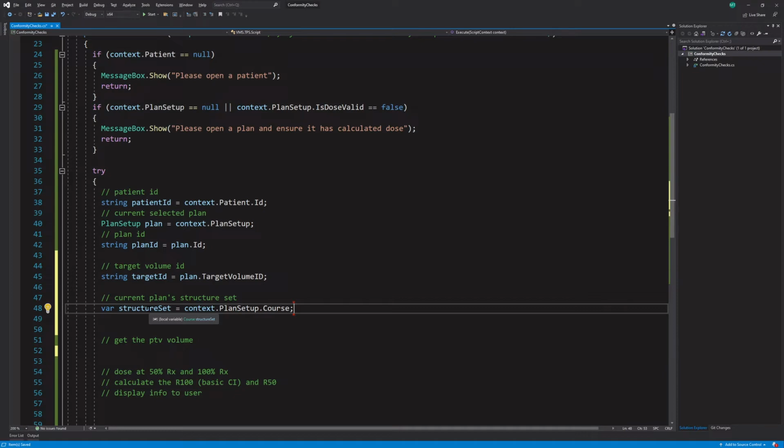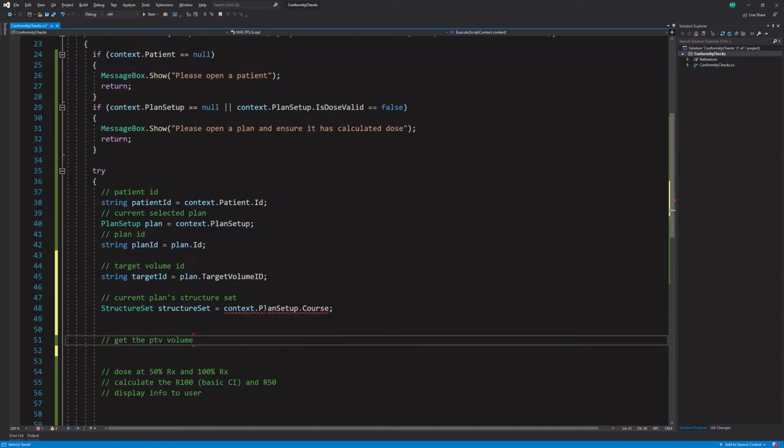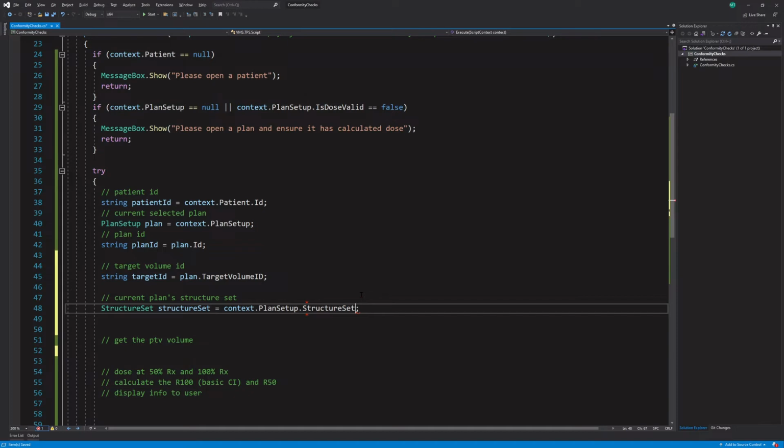So if I hover over a structure set, it says it's a course, right? But that's why, if we are being explicit, now it's complaining. If we hover over it, it says, cannot implicitly convert type course to structure set, right? So it just can't do that. So structure set. All right.